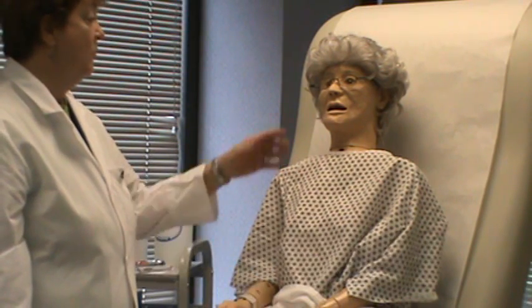So I will do the vital signs, check the temperature, the pulse, the blood pressure, and do her pulse ox. And do you have any pain? And she denies any pain. I would also check her height and weight and do her BMI, and check her Snellen eye chart. She got a 20/20 wearing her glasses, that means with correction. And so she's ready for the rest of the exam.